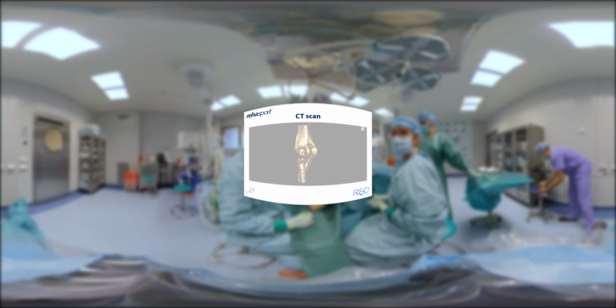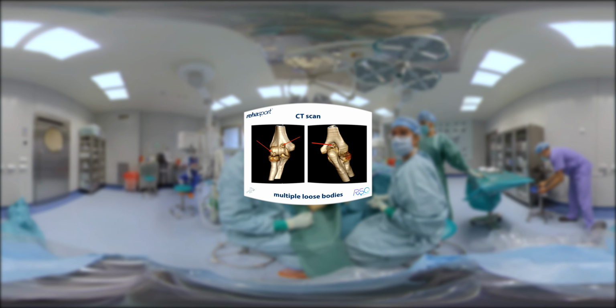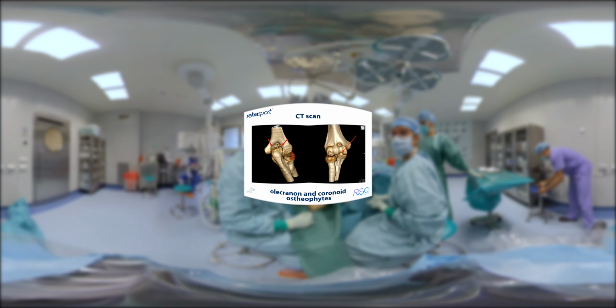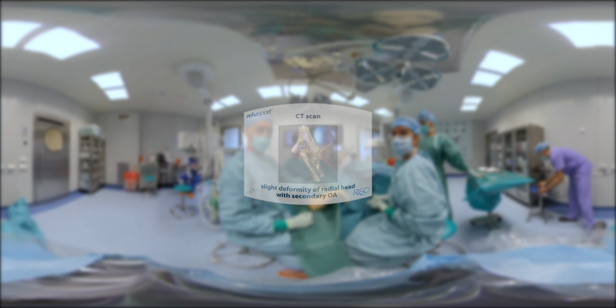CT scan reveals secondary arthritic changes. Multiple loose bodies, olecranon and coronoid osteophytes, slight deformity of radial head with secondary degenerative changes.